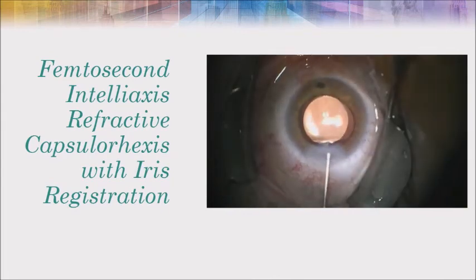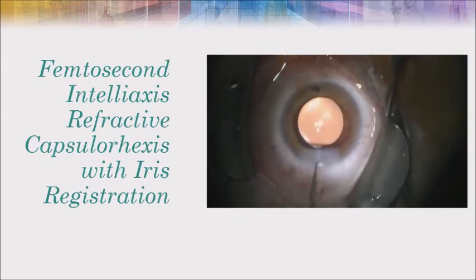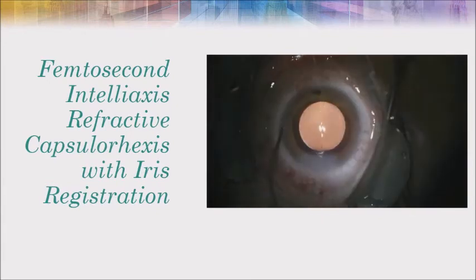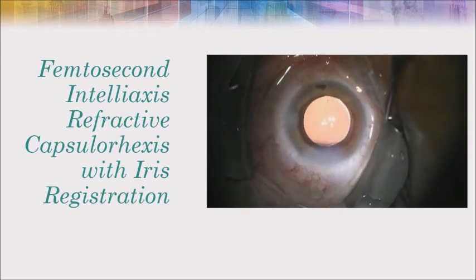And you should be able to see those little nubs when you remove the viscoelastic. If the lens moves off of the nubs, you just move it back, which is what we're doing here at the end of the case. So it makes it very, very simple. I don't have to mark in the preoperative area. I don't have to figure out if the patient had cyclotorsion when they went supine. It was registered with the laser, and the laser marked the axis in the plane of the lens.